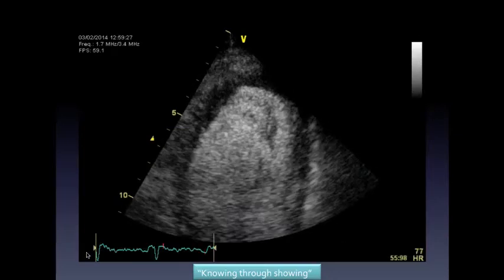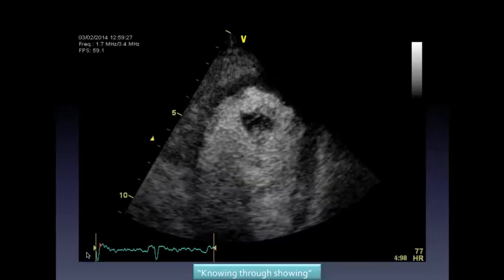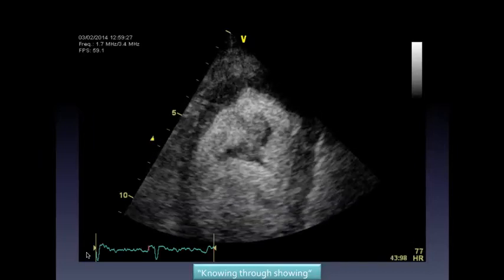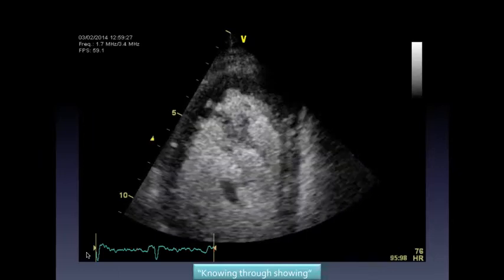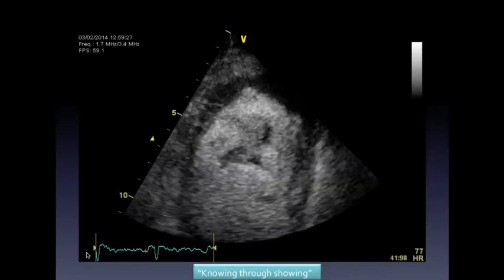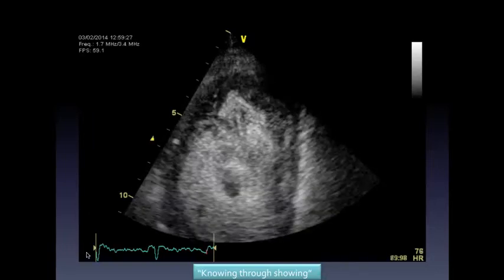Okay? But there is this regional wall motion abnormality, which is quite dramatic, which shows dyskinesis. I hate to tell you, I did that from the ECG, by the way, you know, the gallop rhythm and the heart failure. So just confirming what you saw in the ECG, but massive dyskinesia, very low flow. You don't need to measure the cardiac output to know that the cardiac output is going to be low here. But luckily, I don't think it is free wall rupture.